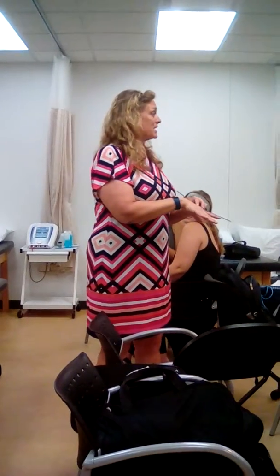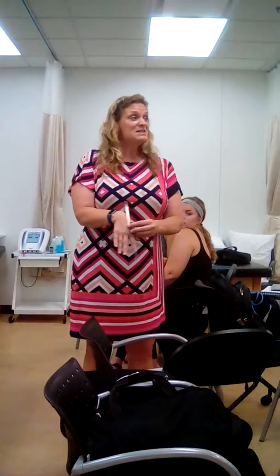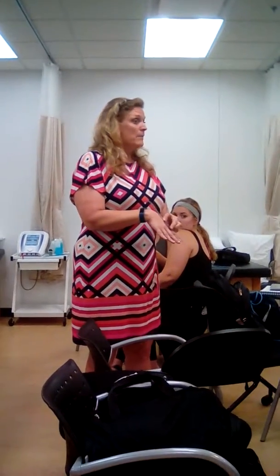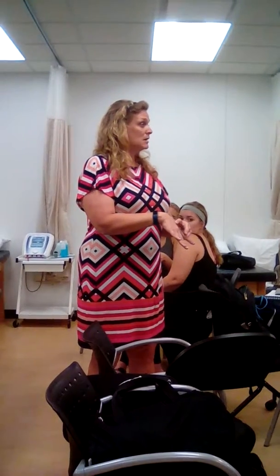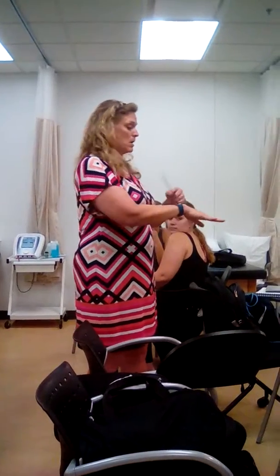Put the axis over the MCP. The stationary arm is going to be right in line with the metacarpal, and the moving arm is going to be in line with the proximal phalanx. You're going to measure abduction — start with the finger straight, and then have the finger deviate from midline of the hand.